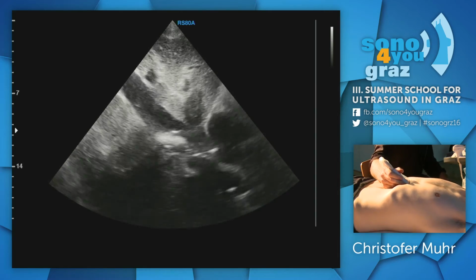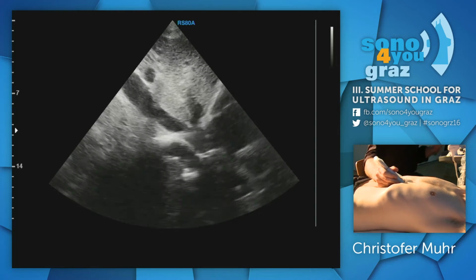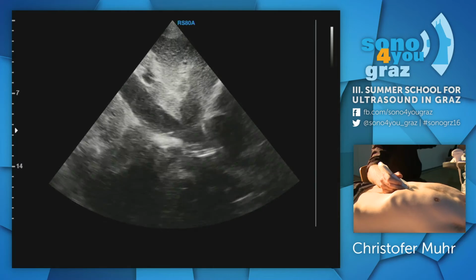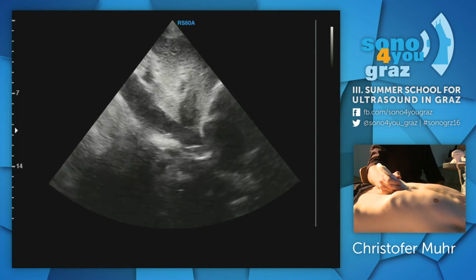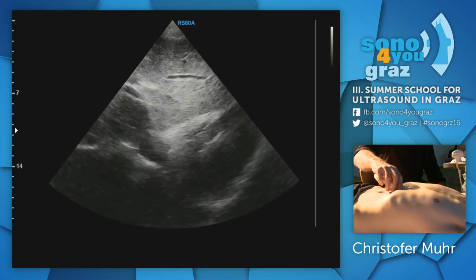All right? And if you're using the sniff test, be careful because some of the patients are going to sniff so much that you're actually going to lose the IVC out of the window, right? So you might be fooled that it's... Do you understand what I mean? Okay? Good. All right.